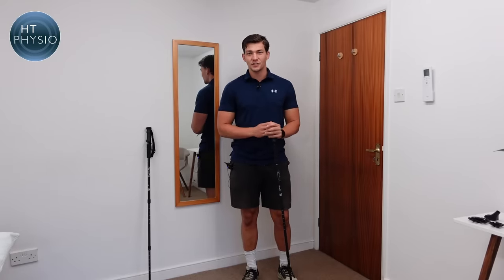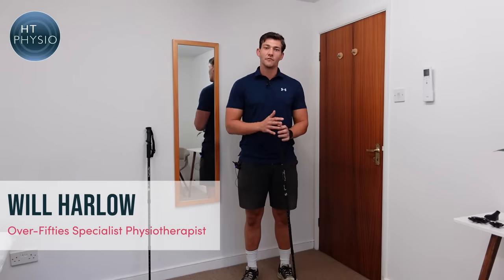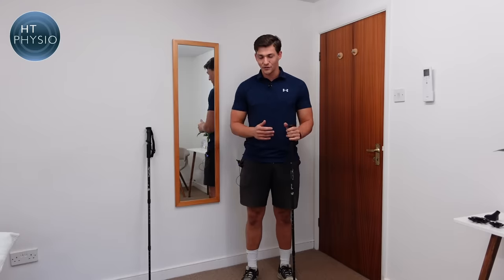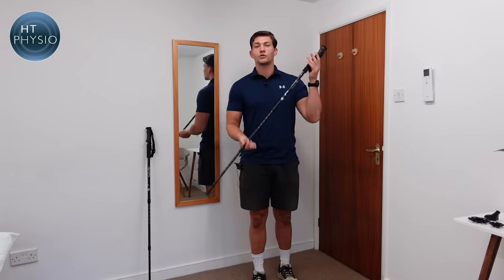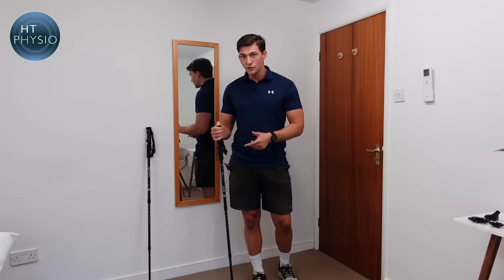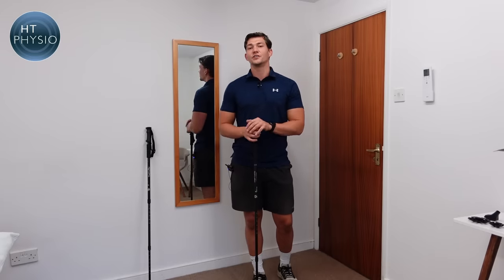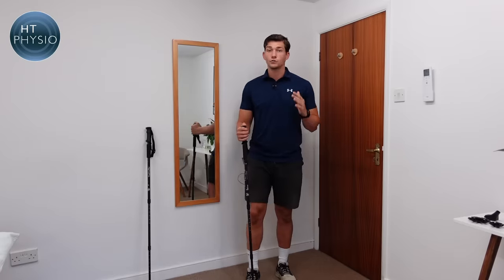Hello everybody and welcome back to another episode of the HT Physio Quick Tips series. My name is Will Harlow and I'm the over 50s specialist physio here at HT Physio in Farnham. In today's episode we're going to be talking about how to use walking poles, trekking poles, or hiking poles. I'm going to show you how to measure them up, how to use them correctly, what settings to use, and how to walk with them for maximum efficiency.